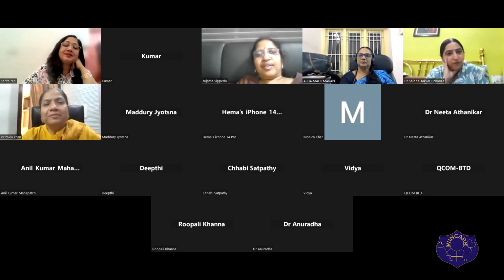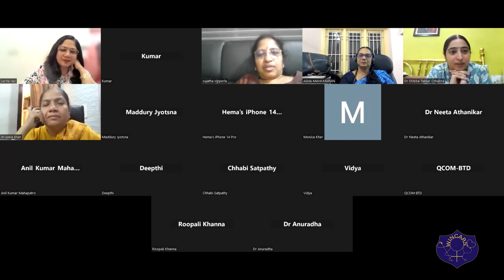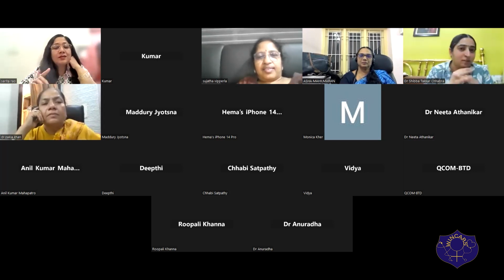So for the benefit of discussion, since we are discussing orbital atherectomy, Sarita ma'am, in which cases should we not be using orbital atherectomy in patients with calcified lesions? Okay. Smaller vessels, the tortuous vessels.